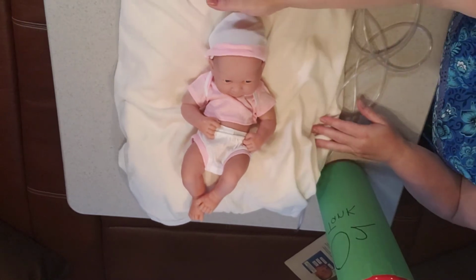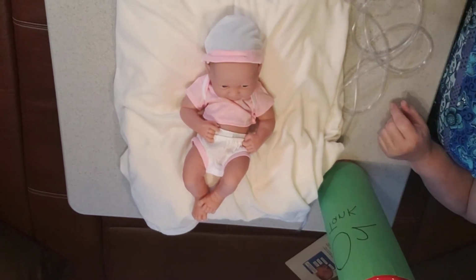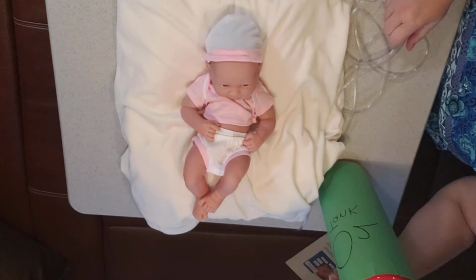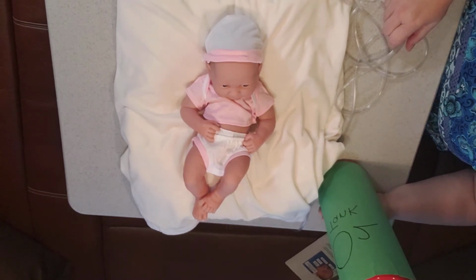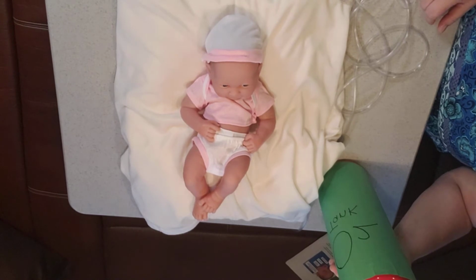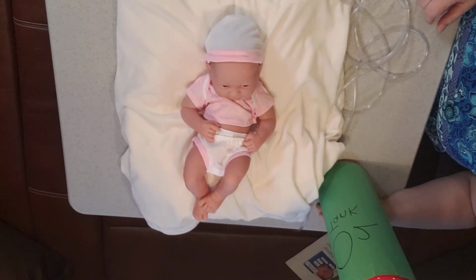Okay, so here we are at the table. This is our little mannequin. We try to get mannequins that are as lifelike as possible. So first we're going to discuss the oxygen tank. This is a portable oxygen tank, much like what you're going to receive from your oxygen supply company. And one of the safety measures is that you don't want it to be standing up. You want to make sure that it's lying down, especially when you're taking her for her doctor's appointments.